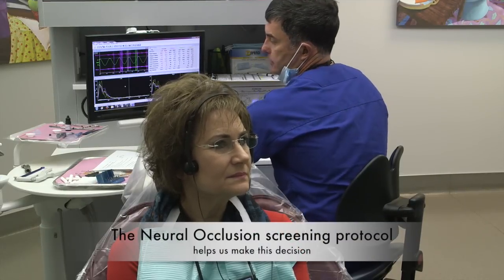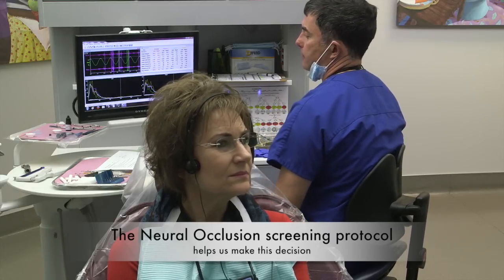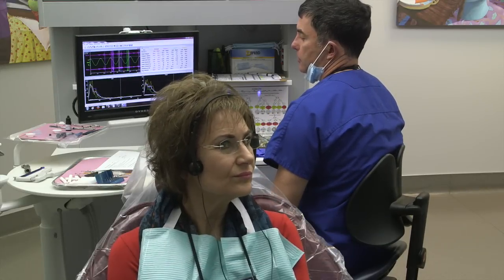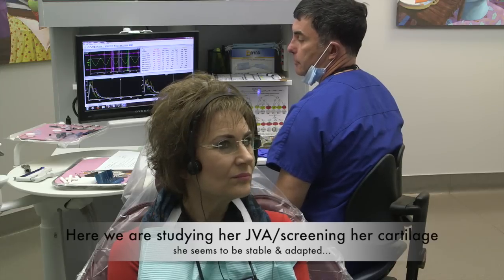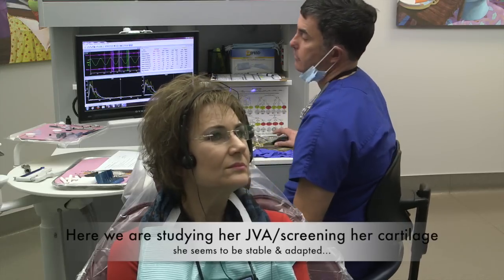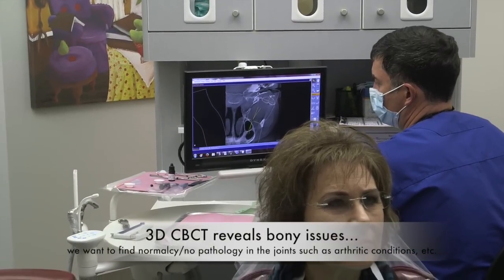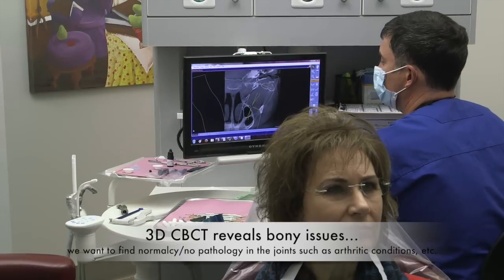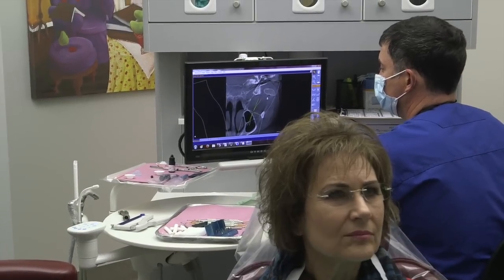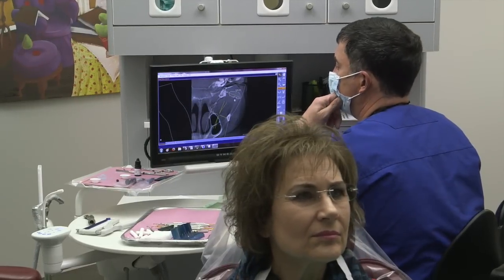The fact that you don't have any waveforms to the right of this dotted line on both sides is a positive thing. Because if you had this kind of squiggly waveform over here, that would suggest bone on bone, which is bad. The surface area is about 160 square millimeters — that's what you are on a normal joint. The head of the joint, that's the top of your jawbone — the condyle head, they call that.